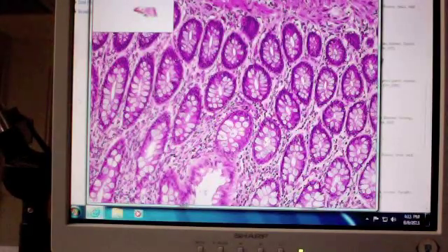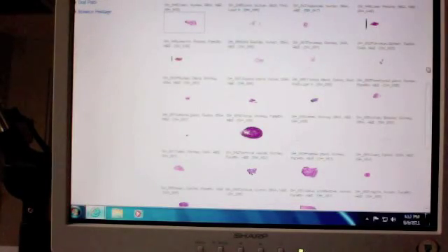You can see each one looks very similar to each other, but this doesn't look like anything simple and straight. Now, I wouldn't give you this in an exam, but just understand that because you have straight tubular glands, they have an orientation, and you can cut them in cross-section and longitudinal section and see different things. That becomes important because of the next thing we're going to look at.